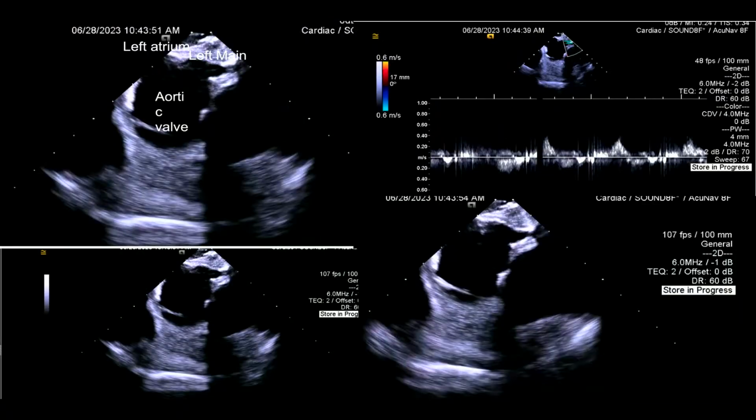This is our aortic view. When we're already done with the procedure, we're coming out. The TEE people have, oh, this is our aortic view, that means we're finishing. When we start looking at the left main, that means that we're on our way out. So you can see here the narrowing pretty clear, right? This is a patient with bypass, and we were seeing that the left main was significantly diseased. We even do color, and then we put the velocity and all that, something to look into.